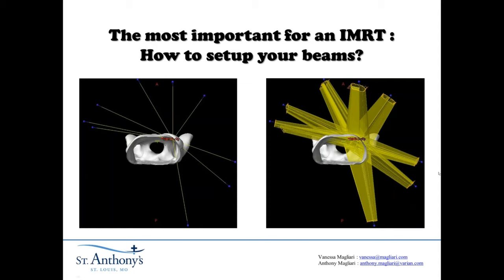Make sure you have a beam that bisects that and creates the place where the jaw or the leaves can be right against those two and create that gradient. In this case, it's the chest wall. You've got to have a 3D representation. Normally when I treat these in the clinic, I do a coplanar arrangement. But I'm allowed up to three non-coplanar beams for this competition, so I try to take advantage of that. This particular beam arrangement is non-coplanar.